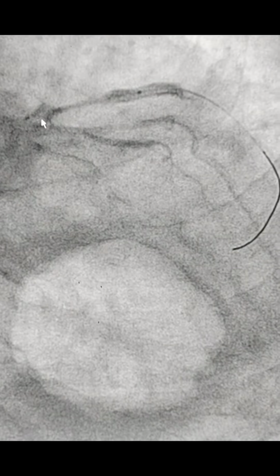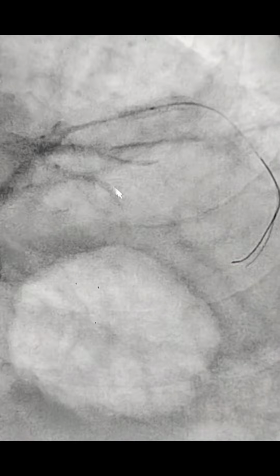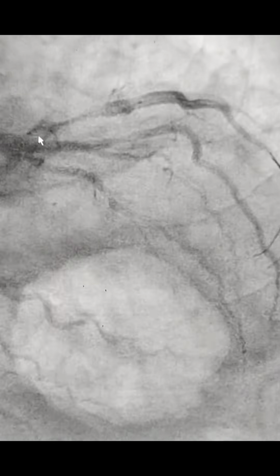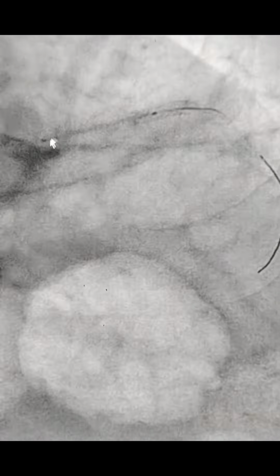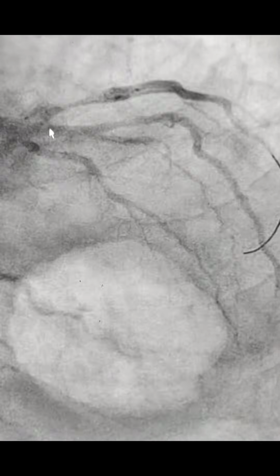This is the ostium of the major LAD, and this is all thrombus here. But the thing is, because the angle of this major LAD to LM is almost around 90, there was a problem of placing the stent.